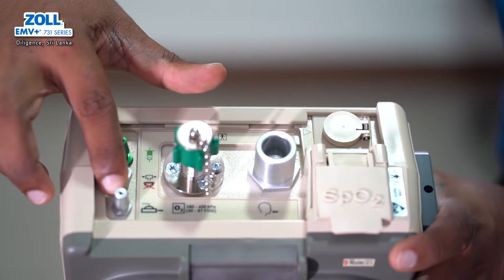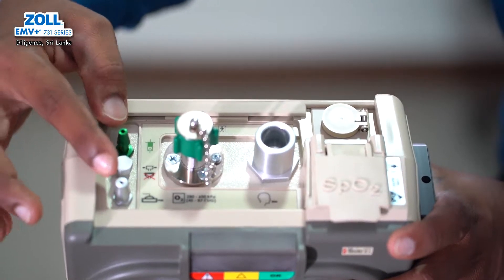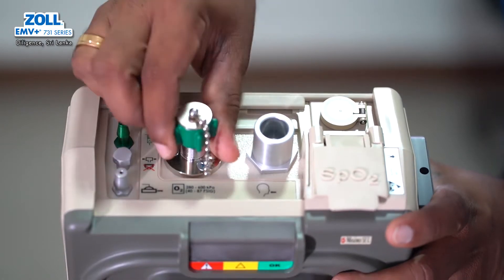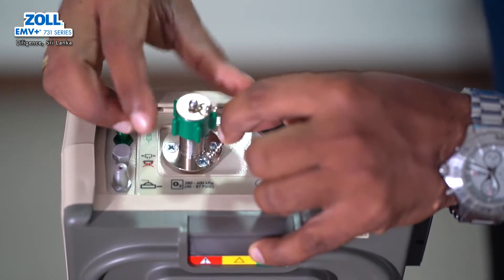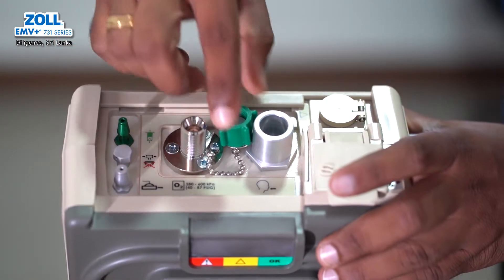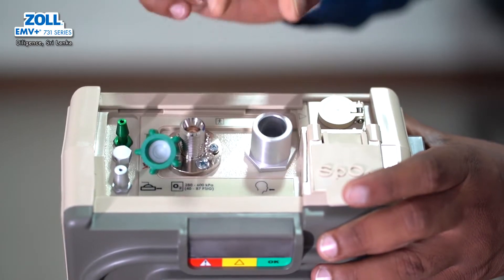Then you can connect the exhalation sensor. The inspiration and exhalation use color coding. You can connect the tube set. In the green color, you can connect the high-pressure oxygen supply and the separate oxygen supply. You can connect the oxygen hose and the main tube to the breathing circuit.